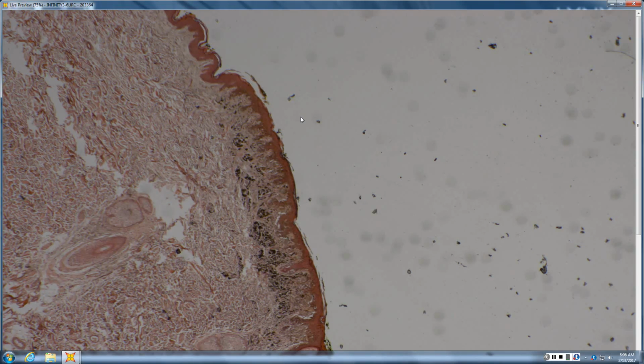What would Dr. Reed have called this? Pigmented spindle cell. So pigmented spindle cell nevus of Reed is like a small spindle cell Spitz on the extremities, proximal extremity of women. They tend to be eruptive, so you have this dark thing that just appeared. And, you know, she's 32, she's got a kid at home, she doesn't want to take any chances, she says, cut this thing off. So it's not uncommon that they're biopsied or excised, but the clinician usually tells you, boy, it was really dark, but it's small and it's well circumscribed, but she tells me it's brand new.